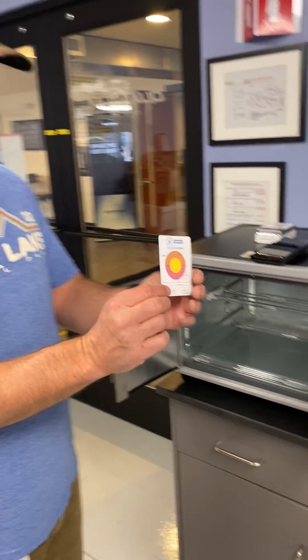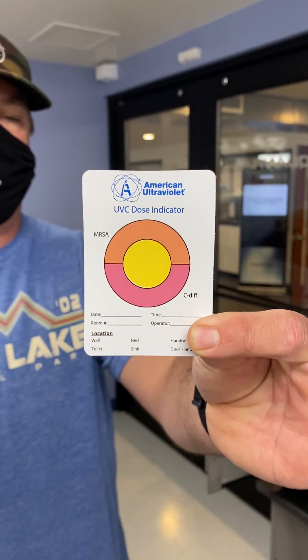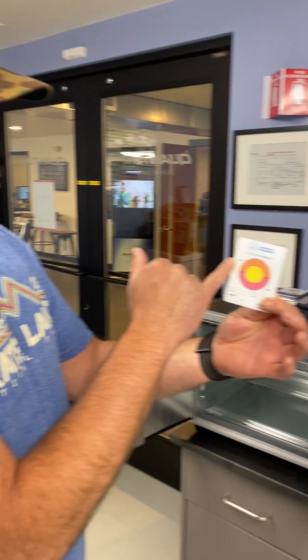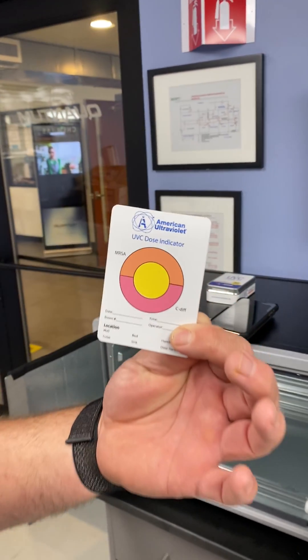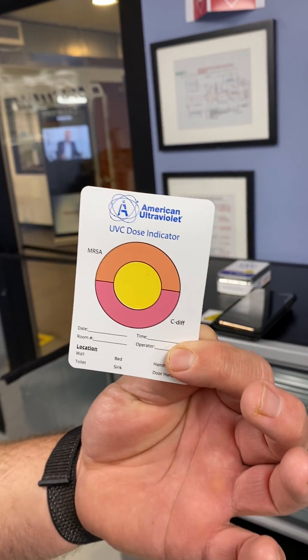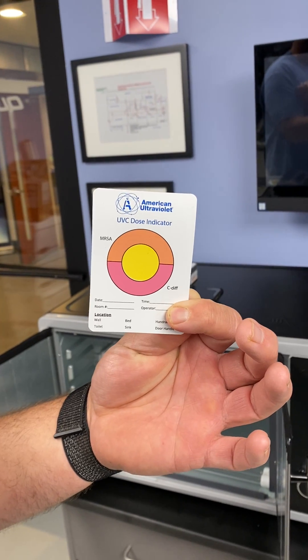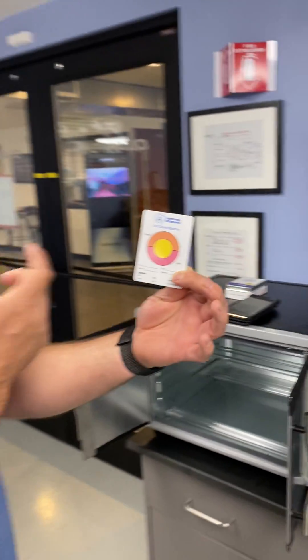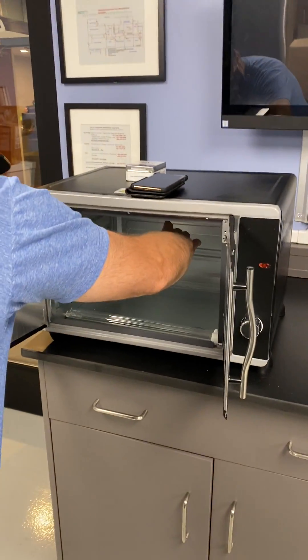I'm going to take a card like this, which is a UVC dosimeter card. This is commonly used in medical offices. What we have on the top is MRSA and on the bottom is C diff. The yellow in the middle is going to change colors when we are able to inactivate MRSA, and then it will change pink when we're able to inactivate C diff.